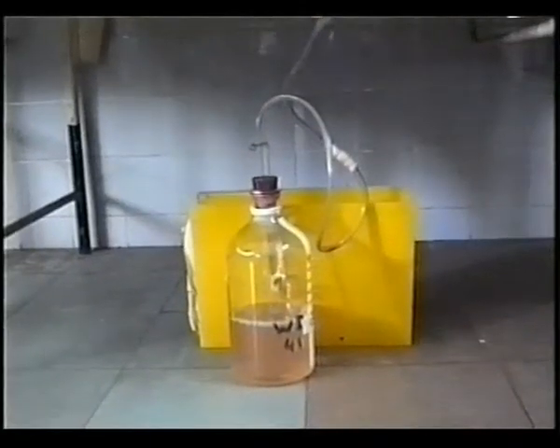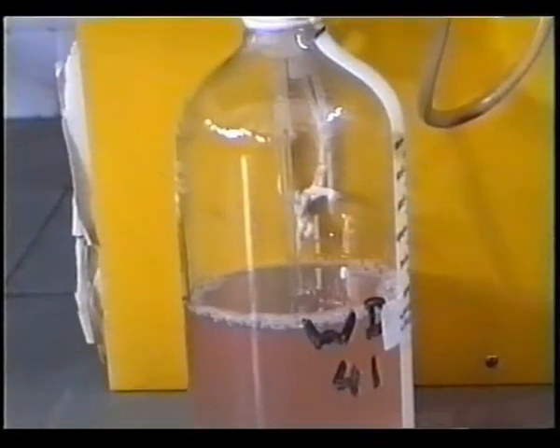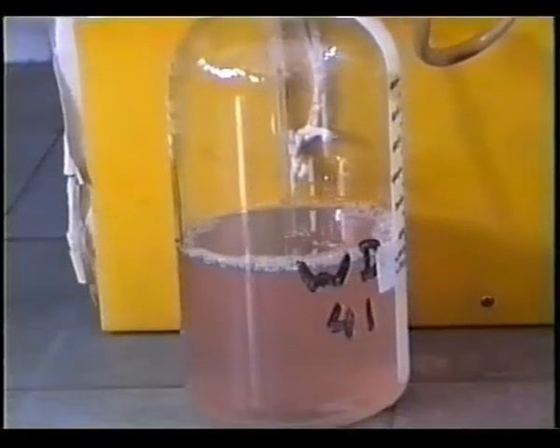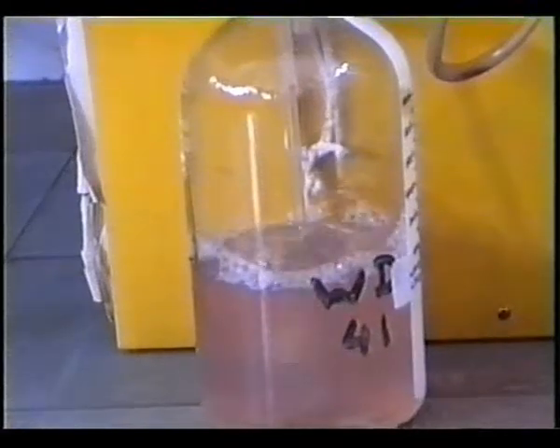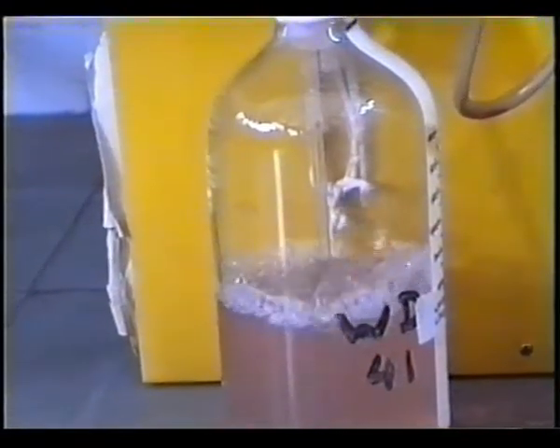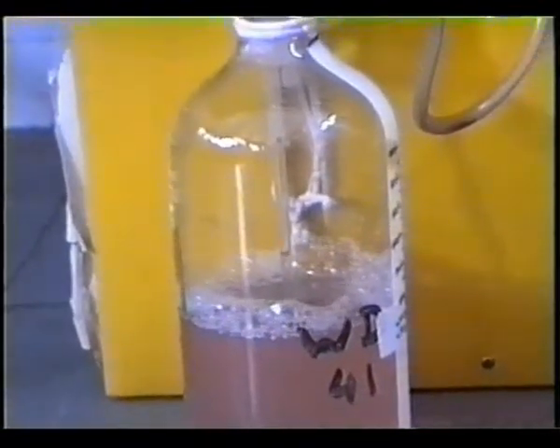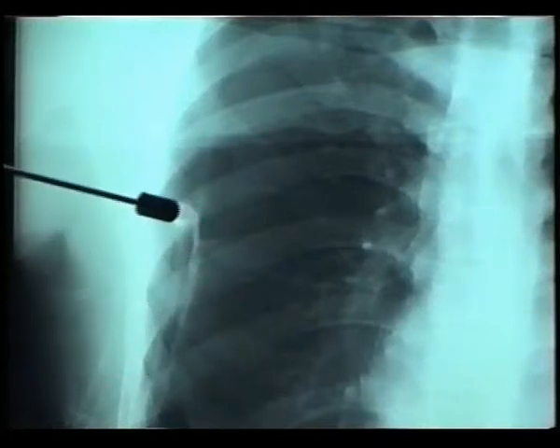Later, we inserted an intercostal tube connected to an intercostal drainage system. You can see the air fluid level moving up and down, and when the patient coughs, the air comes out the tube. This is a water seal drainage system. This is the chest X-ray showing the intercostal tube in the pleural cavity.